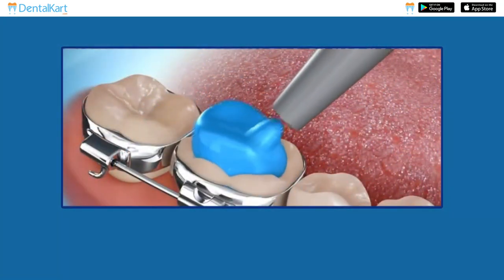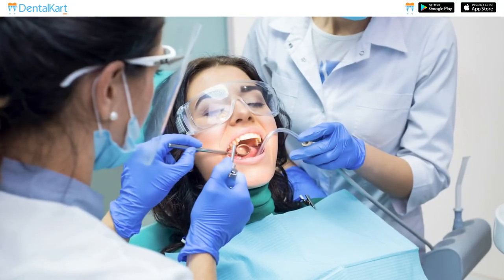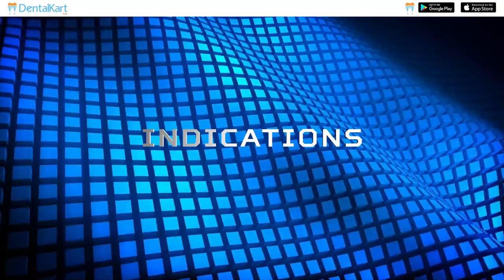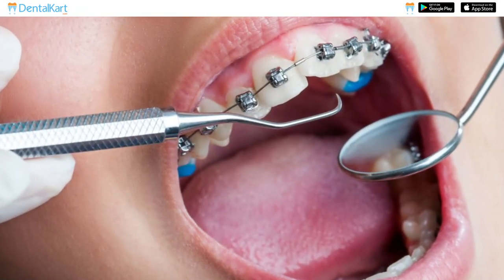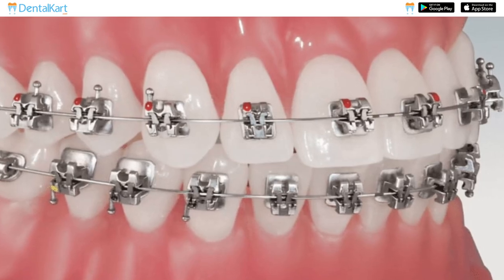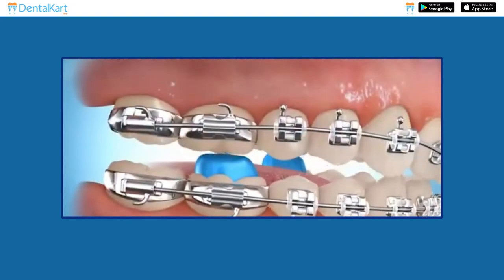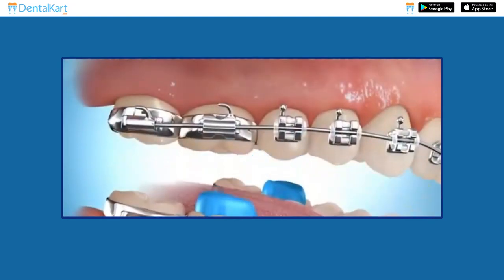They have an ideal consistency, making them easy to handle and apply with a twist syringe, providing convenience during procedures. They are used to assist in proper bracket positioning during the early phase of orthodontic treatment. Bite blocks prevent brackets from breaking off when the jaw is fully closed, ensuring their stability during treatment.